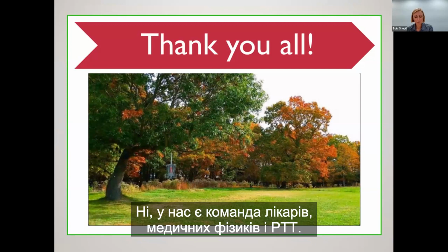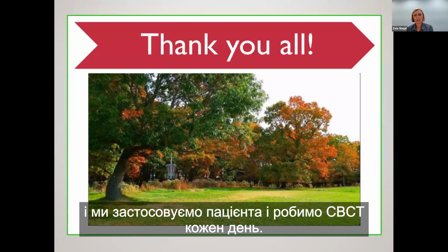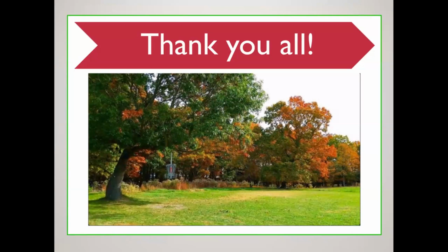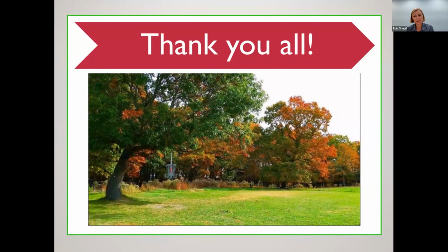We have a team, the doctor, medical physicist and the RTT, and we place the patient and do CBCT every day. Do you look at the CBCT prior to each treatment? Yes, we look. Does the doctor, does the therapist, what's the process? First fraction with doctor and medical physicist. For other fractions, if the placement is good, it's done by RTT. Okay.